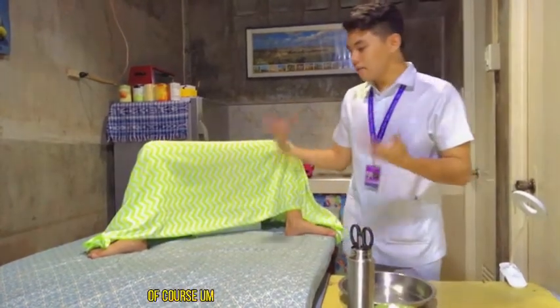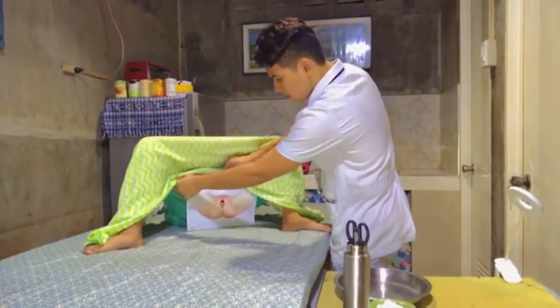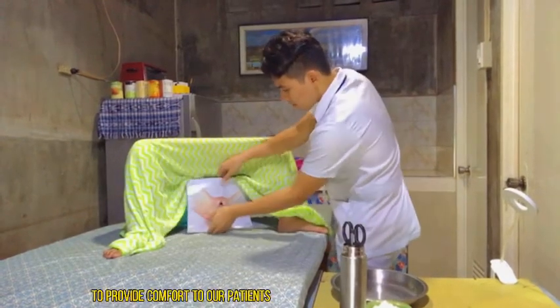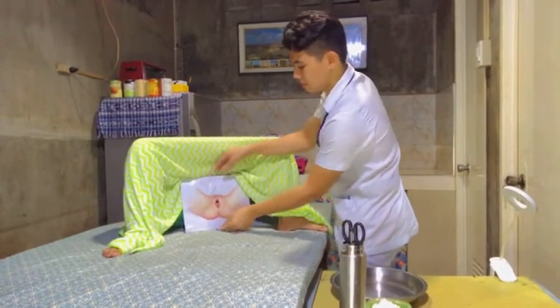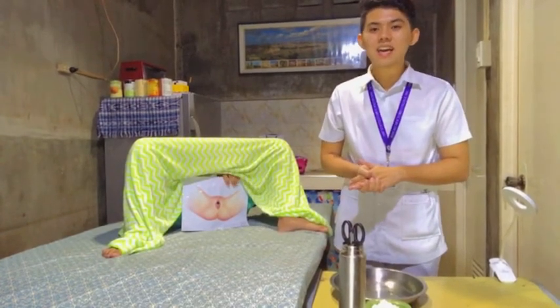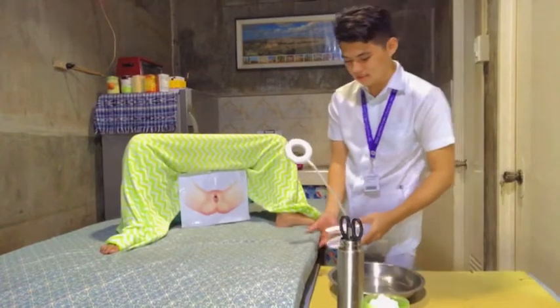Okay. Of course, drape the patient exposing only the part to be exposed. Okay. Make sure to cover this part here to provide comfort to our patients. Okay. So, of course, next we will be applying direct light for visualization of the genital area that will help us see clearly upon inserting the catheter. So this is my improvised light.